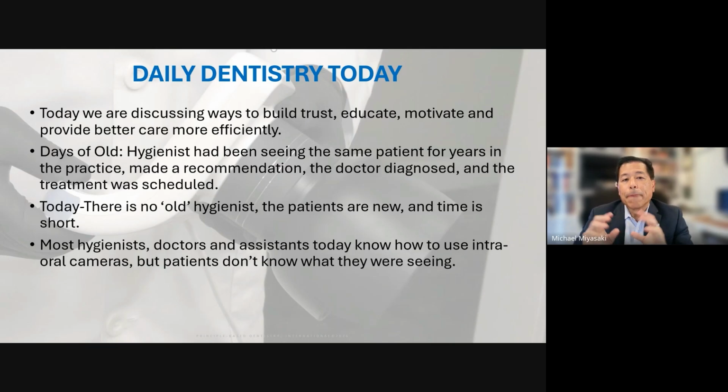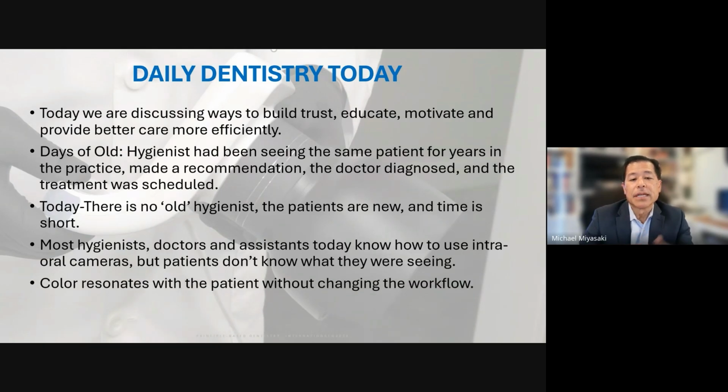And so most of us in the back office, your hygienists, your doctors, assistants, we know how to use intraoral cameras and we show the patients things, but again, do the patients really understand or value the images that we show them? So that's why having this color, I think, is so important, because the color really resonates with the patients. Not only is it diagnostic, and we'll talk about that in its own way, but I think having that color there points out to the patients where the bad is and helps them see that.